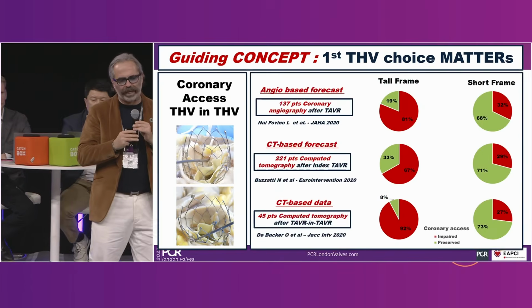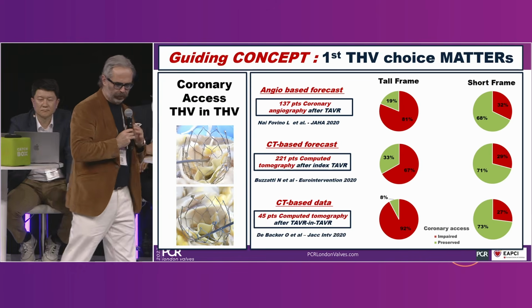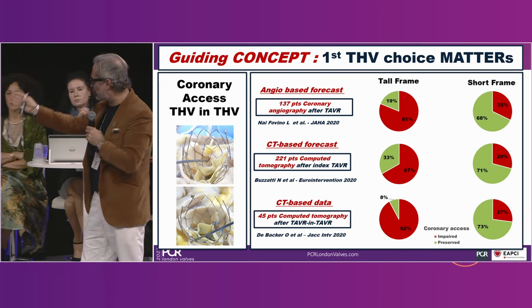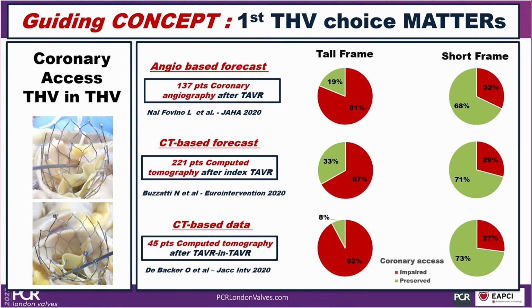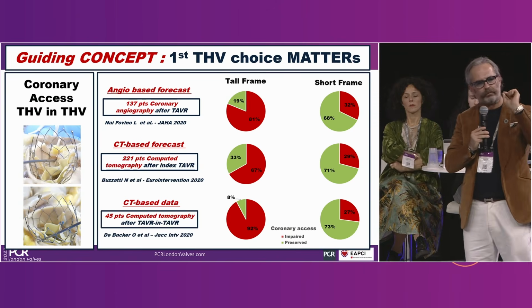So looking at the science around these points, we have 3 different papers, 3 different groups. The first one is from Padua, then we have New York, and the last one is Ole. And here you can see pretty much consistently that a tall frame valve in 2/3 of cases may create some problem in terms of coronary access. We're talking just about coronary. We're not talking about pacemaker, gradient, patient prosthesis, etc. The focus is just coronary.